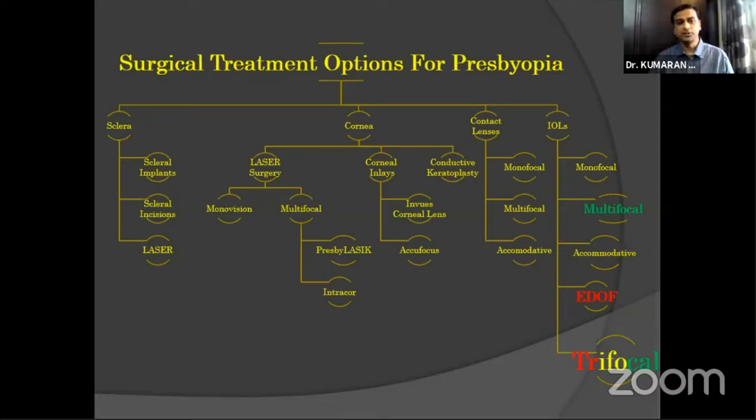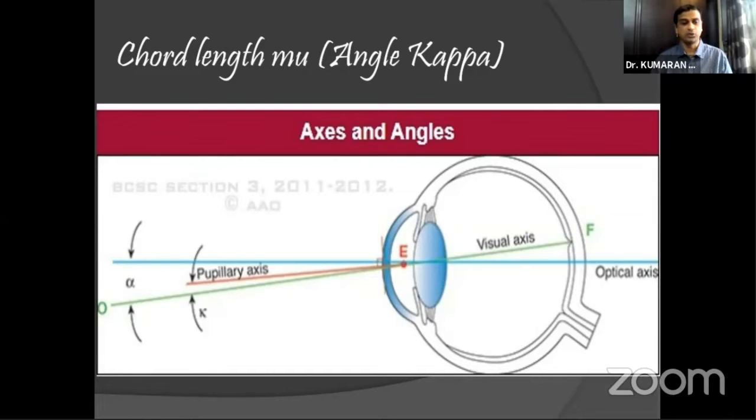But still, a lot of surgeons all over India are a little skeptical about adopting a presbyopic IOL for their patients, because they are scared about the postoperative refractive outcome, or worried about the dysphotopsias the patient could complain of after the surgery. We have seen a lot of patients with 6/6 and N6 where the pupillary axis and visual axis still do not coincide, and there is always a difference. The difference is more when the patient has a phoria or a tropia, where it is enlarged.